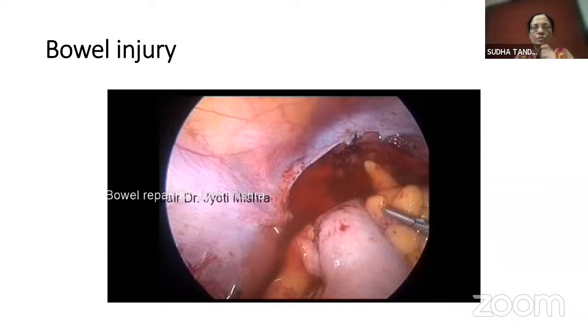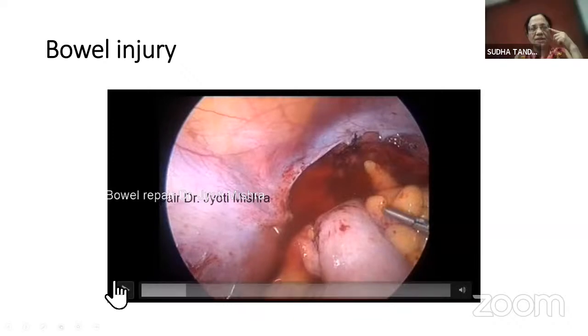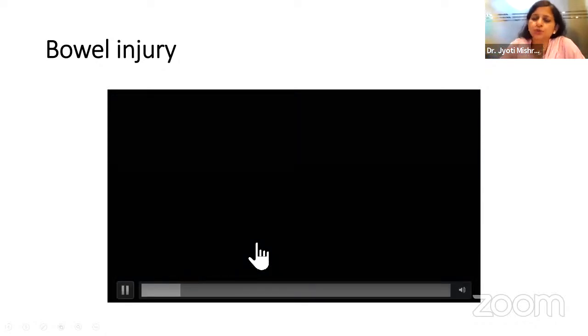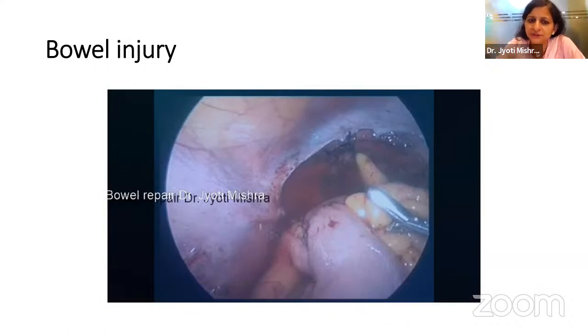If it is an injury because of electrosurgery, you may still see the jet. Thermal injuries can present later. So I think this is a gray zone, as rightly told, and it's the discretion of the case and the surgeon, I would put it. Yes. At the end of any complicated surgery, we should do cystoscopies or at least check the ureters and document in your notes that you have checked the ureters.